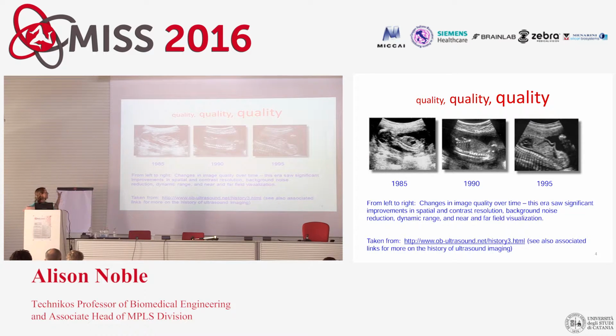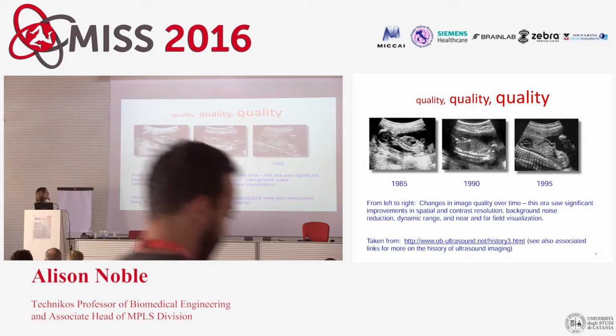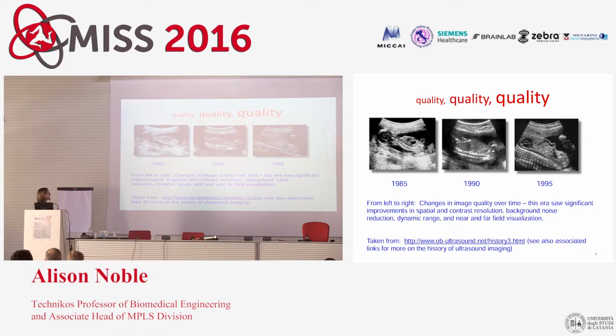Julia Schnabel had this particular figure up. What's important from an information point of view, and information is in the end what we're after, is there have been some dramatic changes in ultrasound, and some of the legacy of this is still why people don't use it. If you go back, this is taken from a very good website which has lots of information about the history of ultrasound.